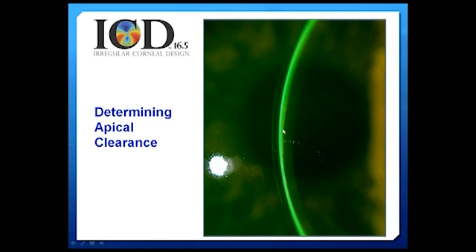In this case, we would guesstimate at the center the fluid thickness is slightly under 300 microns. We would like the lens to go on eye with approximately 300 to 400 microns of fluid. So this might just be an inadequate amount of fluid.